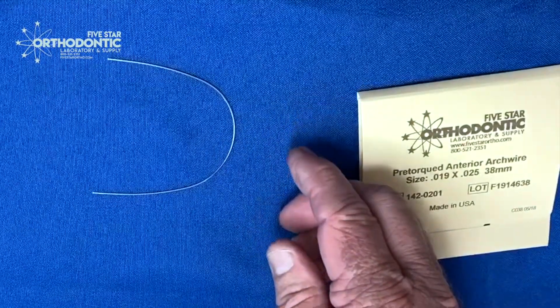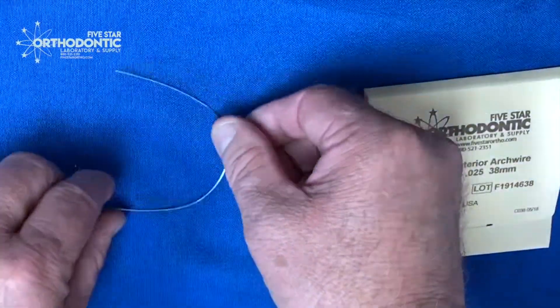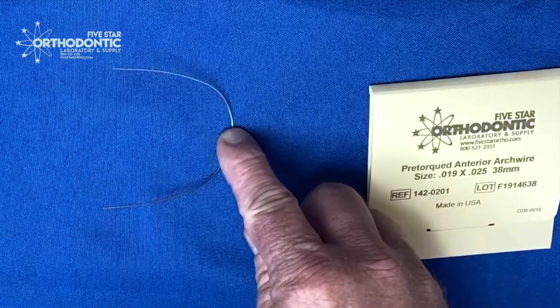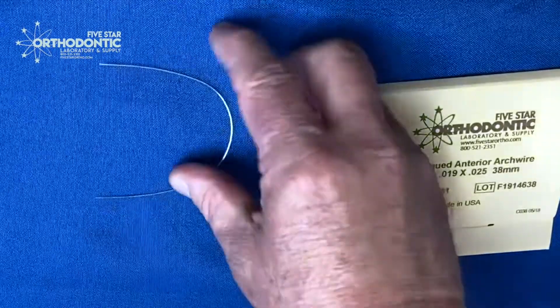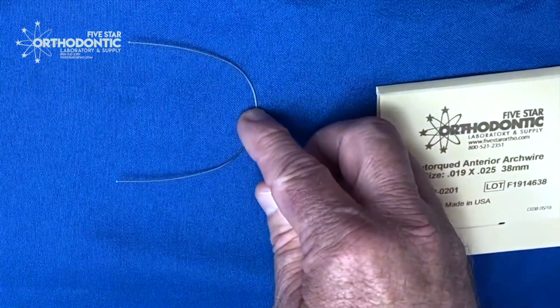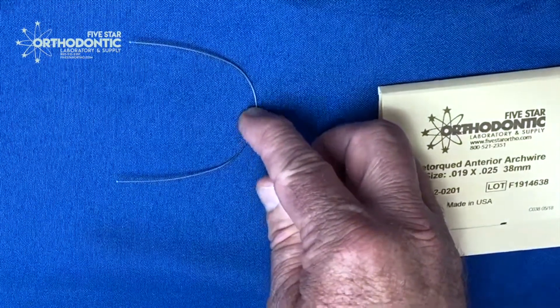Now we can use this wire on the lower, the mandibular arch, and the same thing is going to apply again. On the lower arch, you push it and it flares up — it's going to do just the opposite of the maxilla, tipping the lower anterior teeth to the lingual. Flip it over, push it, nothing happens — it's going to flare the mandibular anterior teeth outward as well.